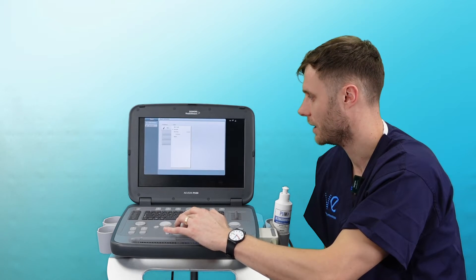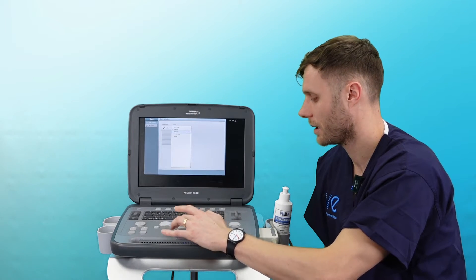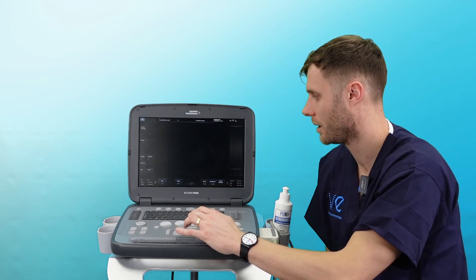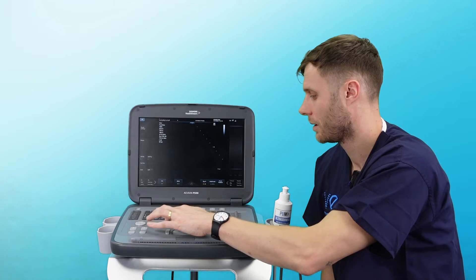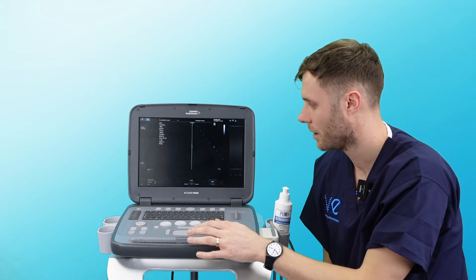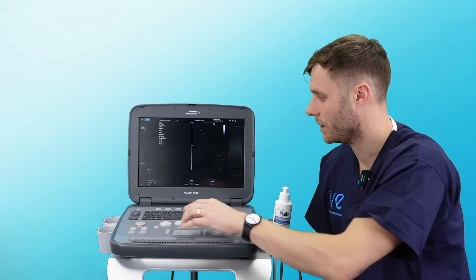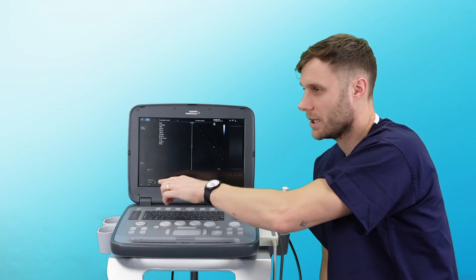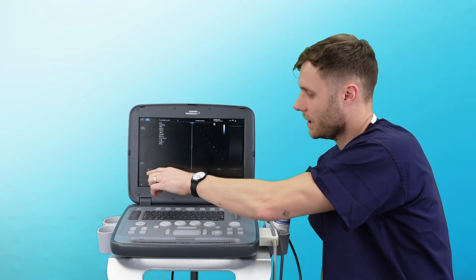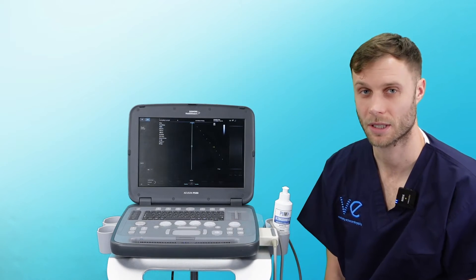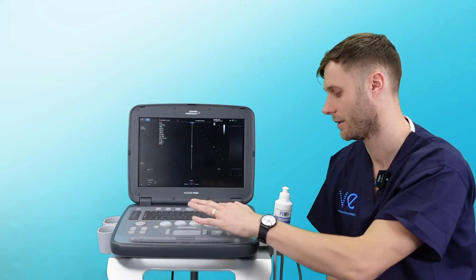In echo mode, if you hit PW and you want a continuous wave, you can hit the CW on the touchscreen to use continuous wave.